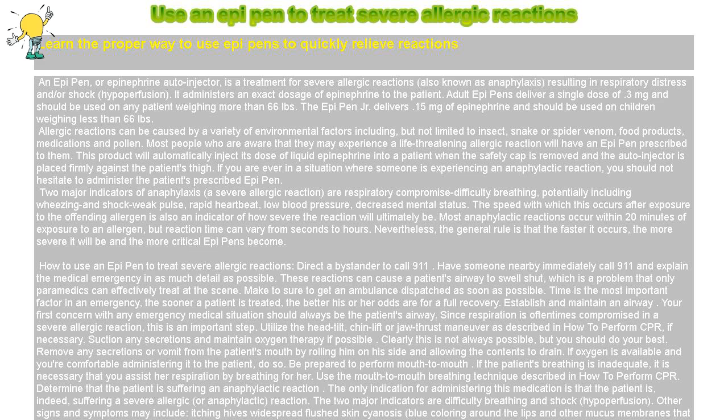Transport the patient to the hospital. Typically you should wait for an ambulance to arrive to transport the patient to the hospital. However, since time is critical, there may be situations where you should drive the patient to the hospital yourself. If you're unsure about whether or not to wait for the ambulance to arrive, ask the 911 dispatcher what you should do. Always transport a patient to the hospital. The effects of the epinephrine dose could wear off in as little as 10 to 20 minutes.